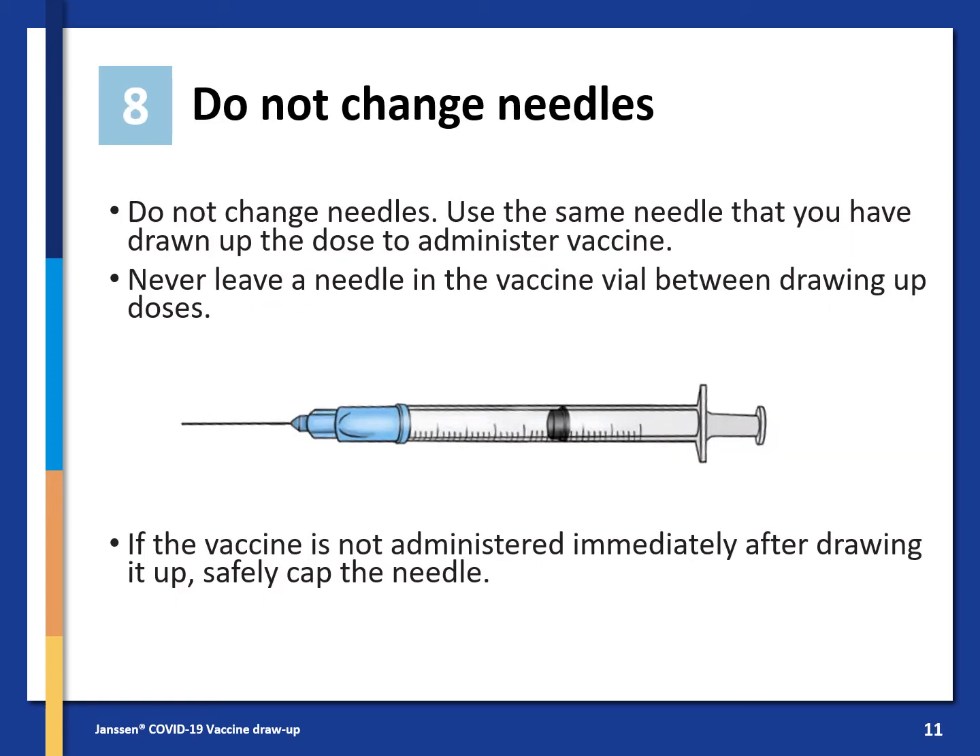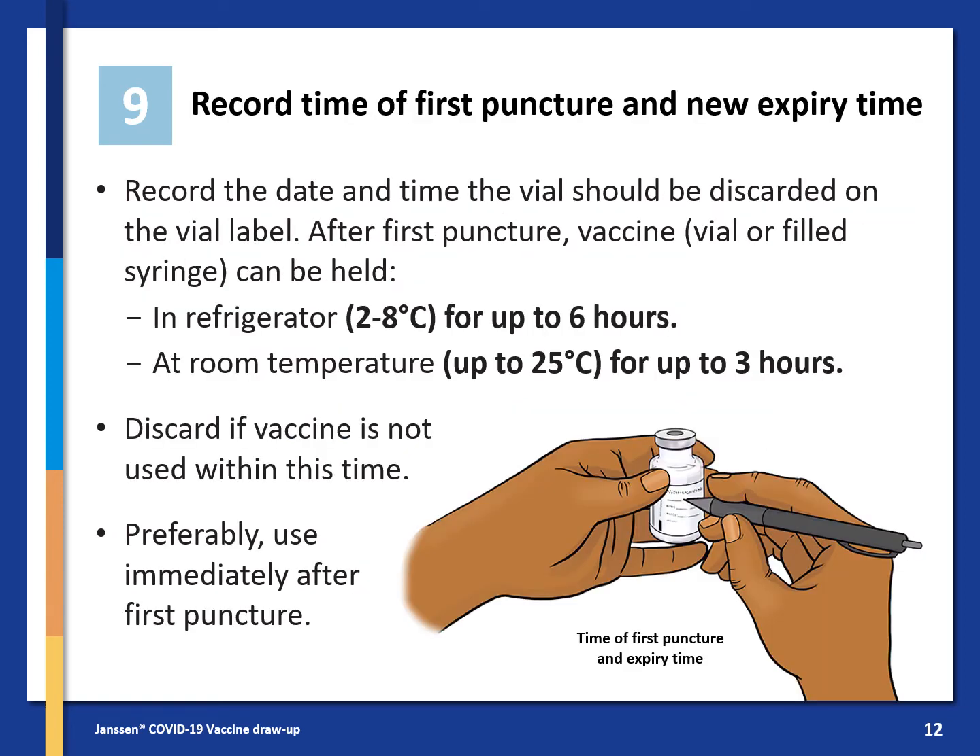Do not change needles. Use the same needle that you drew up the dose with to administer the vaccine. If the vaccine is not administered immediately after drawing it up, safely cap the needle. Record the time of the first puncture and the new expiry time, and record the date and time the vial should be discarded on the vial label.